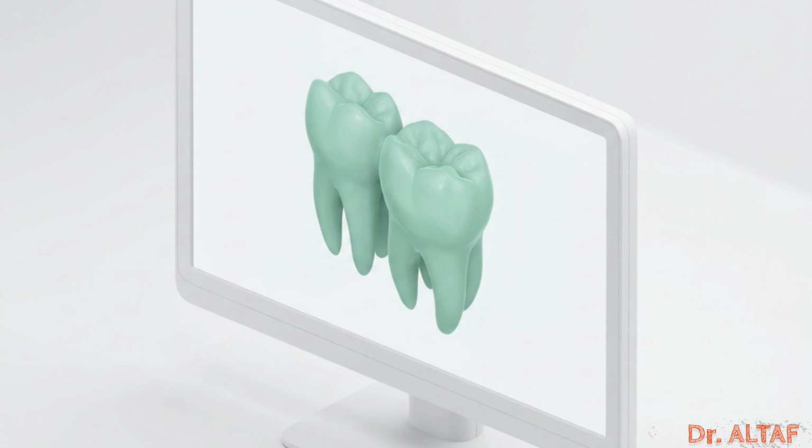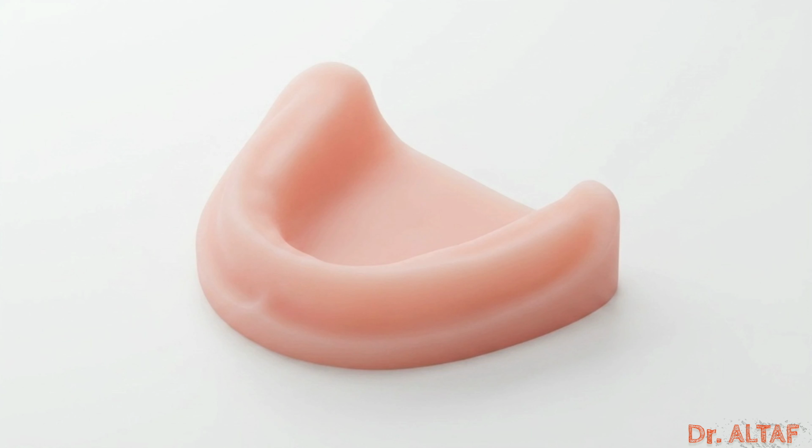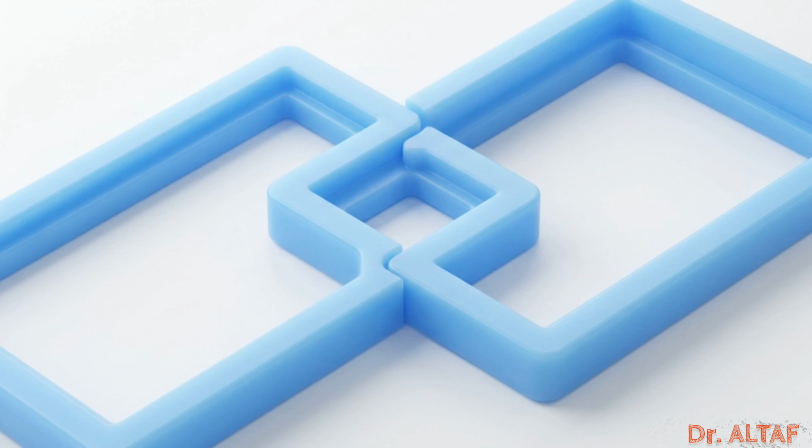Over a short span of one or two teeth, these refraction and acquisition errors are easily corrected, but when we push the scanner across the full expanse of the jaw, these structural weaknesses fracture the data. The ultimate stress test for optical scanning is the completely edentulous full arch case. To map the entire jaw, the intraoral scanner relies on an algorithmic mechanic called stitching.